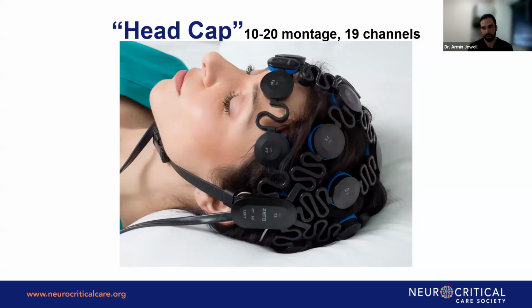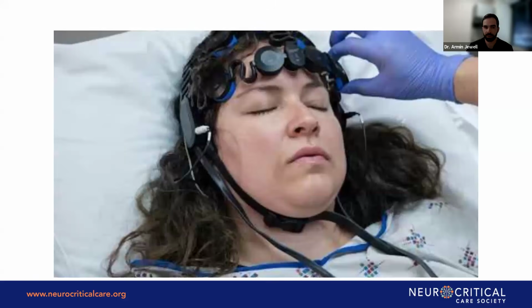However, it is a full coverage cap, so they're able to place the electrodes along the surface, and I'll actually have a video showing how it's placed, so you can get an idea of someone who places it and what it looks like. Those are just different examples of different versions of the point of care EEG that we see and what they look like. I'm going to try and do this video.